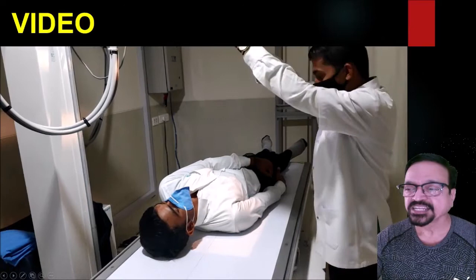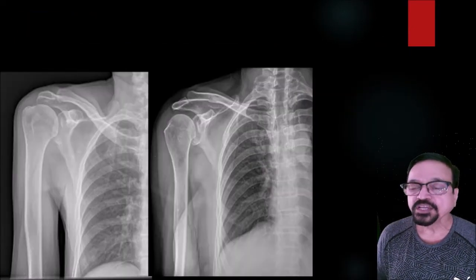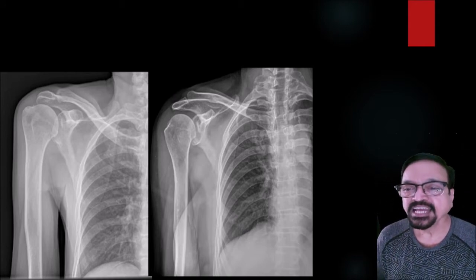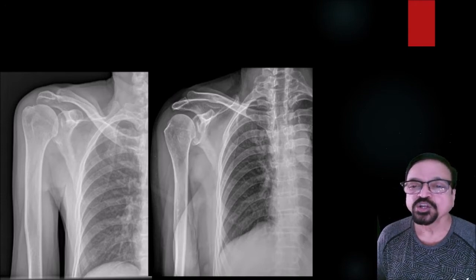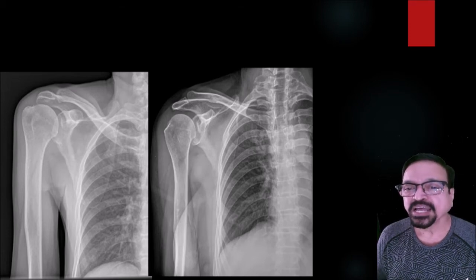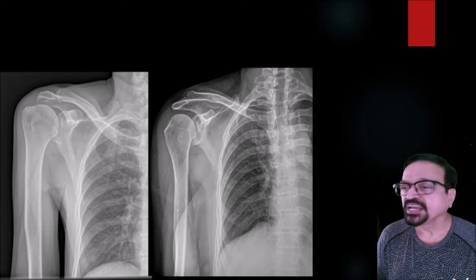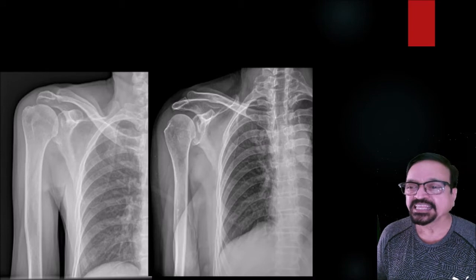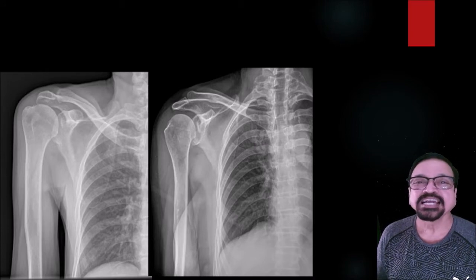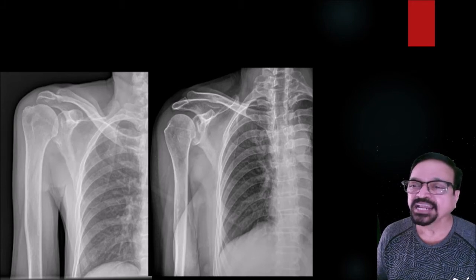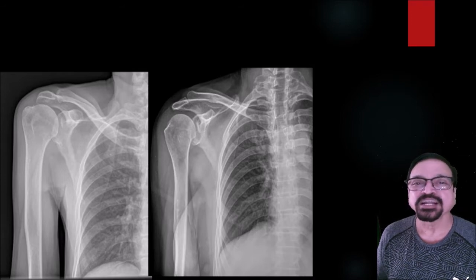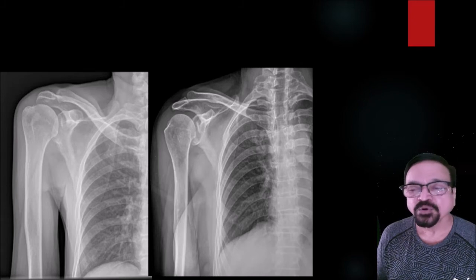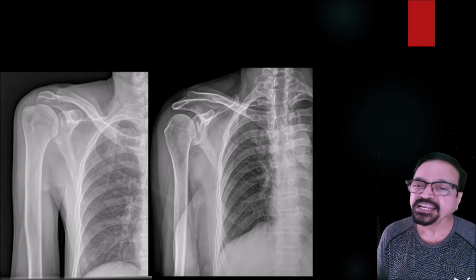The exposure is taken and the x-rays are done. Now here we are seeing two projections. If you see the greater tuberosity, you can know the rotation of the thumb — whether it is inside or outside. Care is also taken to center on the acromion process. The second one has got inclusive of the cervical spine, as there is obviously a pathology of the cervical spine. So sometimes it can give you an idea about that. Also, if you want to know the clavicle — especially if trauma is suspected or there is patient pain — we try to include that part while taking the radiograph. In that way, a Bucky or a larger cassette is used.